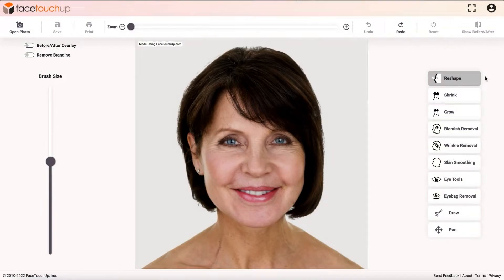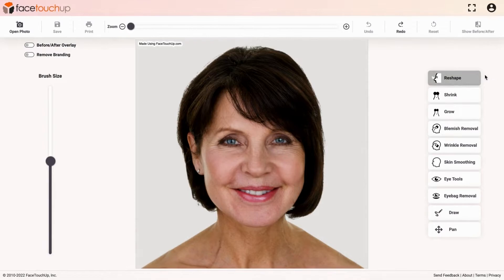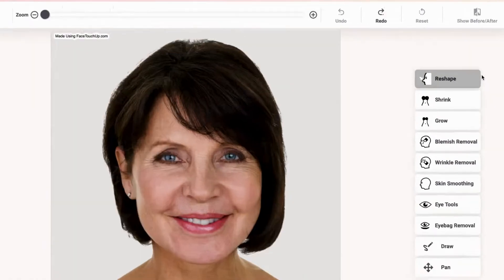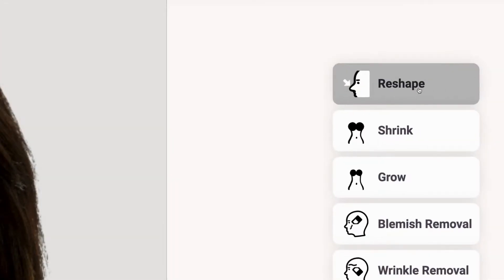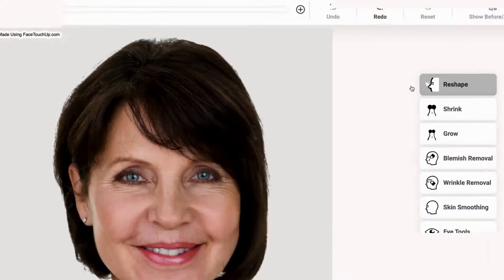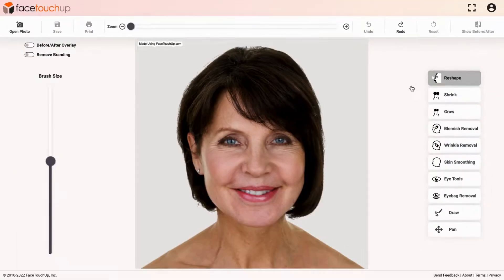The reshape tool is the most helpful tool when simulating facelifts and changing other facial features like cheeks, jawline, and eyebrows. Select the reshape tool and zoom in on the area that needs changes.